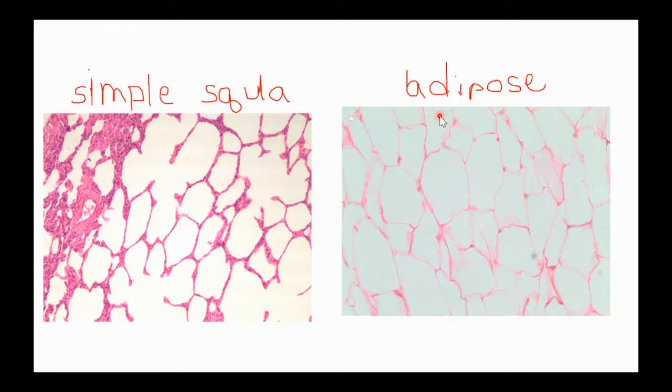Remember, we read the article about white fat and brown fat, and we need to be able to identify how those two are different. When we talk about white fat, remember that those cells had one big lipid droplet. So this big empty space that you see inside these cells, that's where the lipid droplet would have been if this cell was alive.